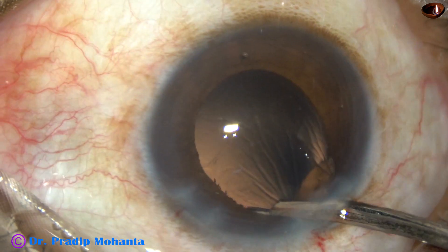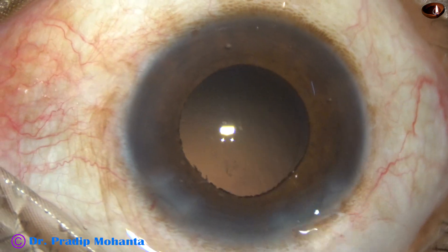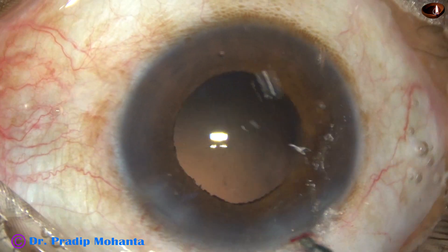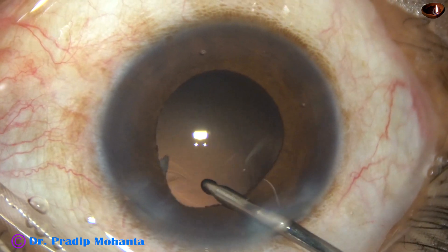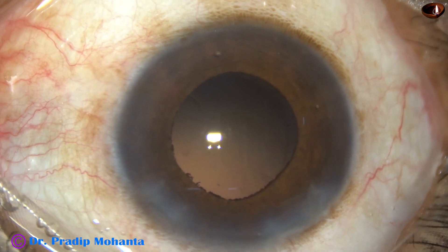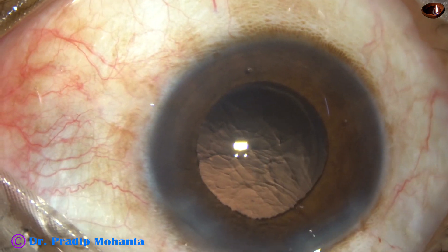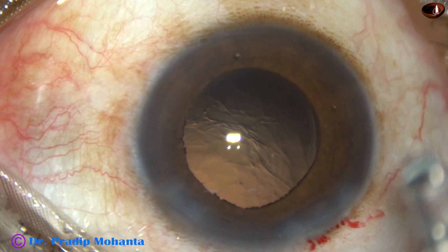The cortex has been nicely cleaned. This is the last portion of the cortex. Some little fibers are still sticking to the posterior capsule — I am going to use the irrigating probe only to do hydropolish. It is done. There is a piece that has to be removed — this is not cortex, this is actually a small piece of nucleus or epinucleus, and it comes out. After injecting visco, I depress the posterior leaf of the main wound and it comes out.